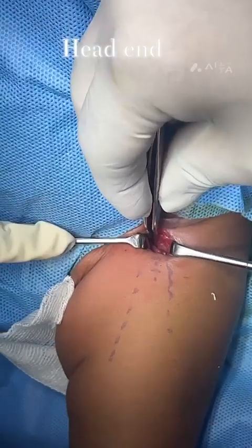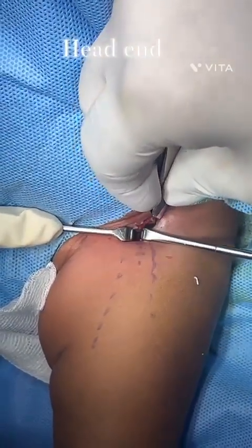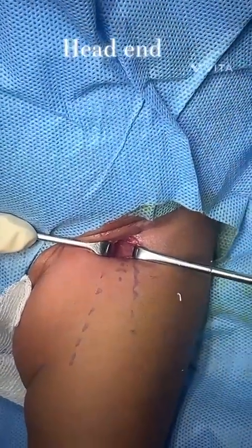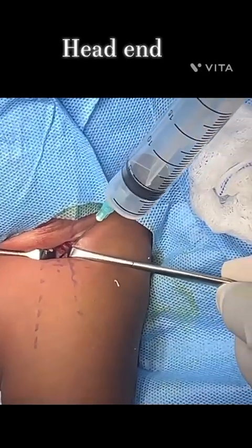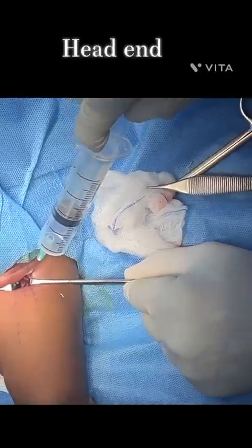Take this. So this shiny white layer which you can see here is the capsule. Once we see the capsule, we confirm by piercing the capsule and aspirating. But nothing is here since I have already aspirated from the medial side.